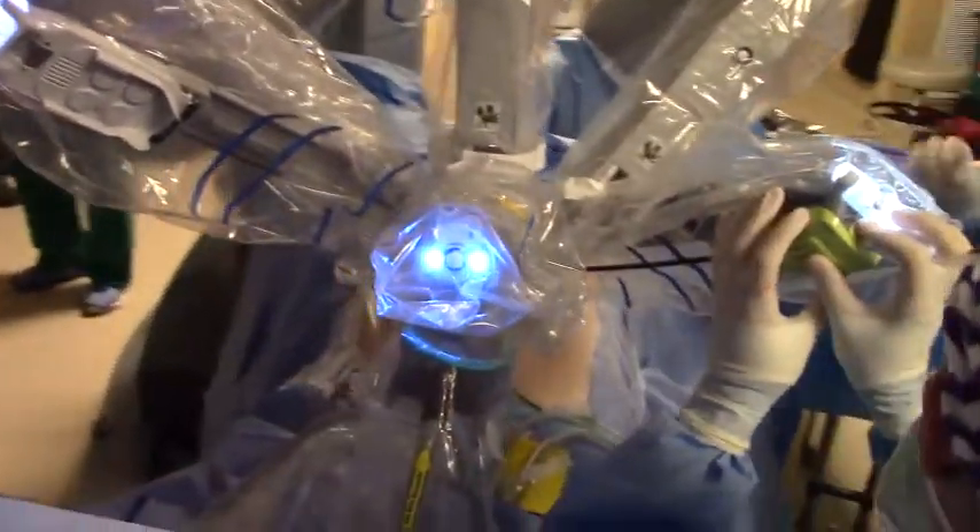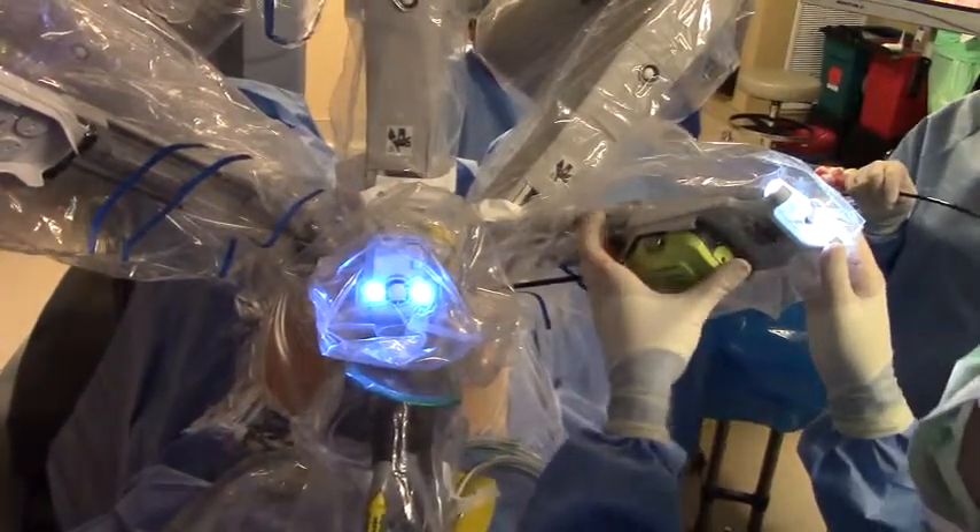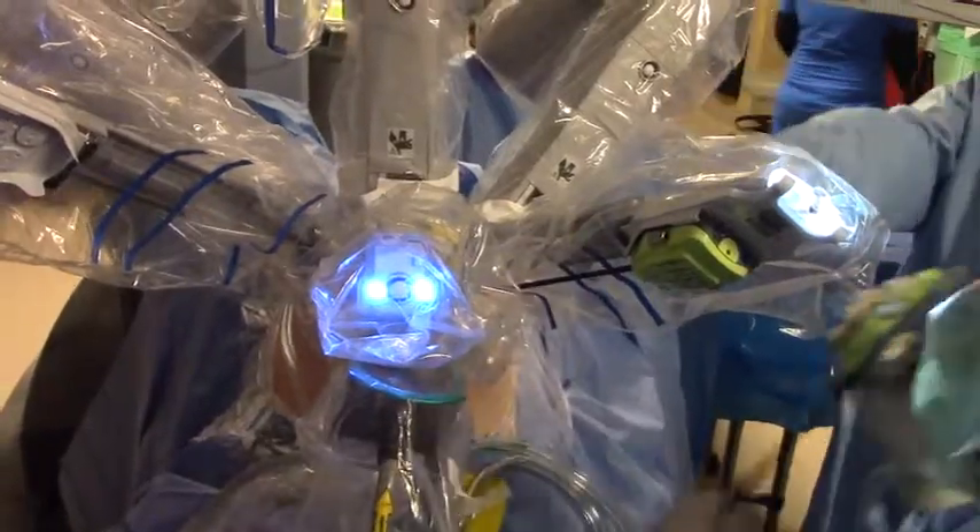So we need to put the right hook. I'll actually do the surgery on the right, and then she has a fenestrated bipolar. So she can just keep the fenestrated bipolar.